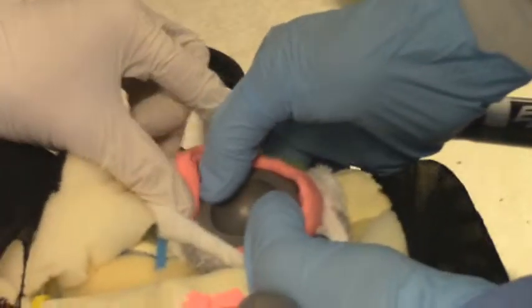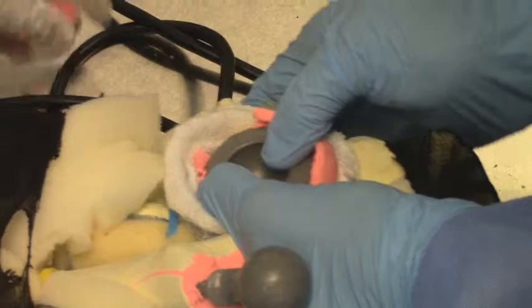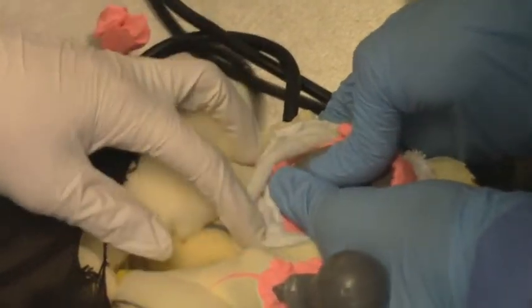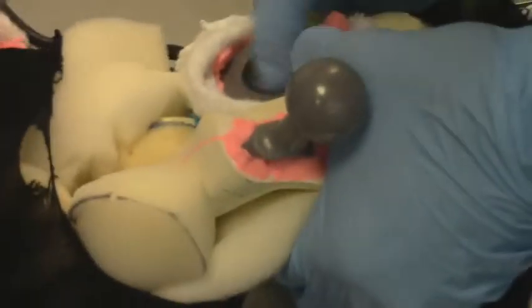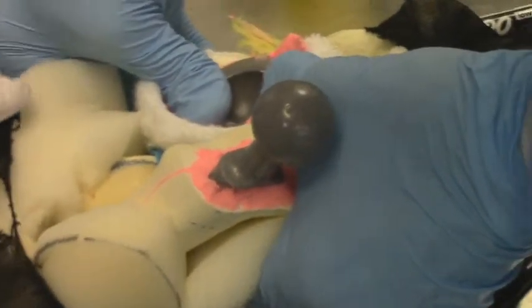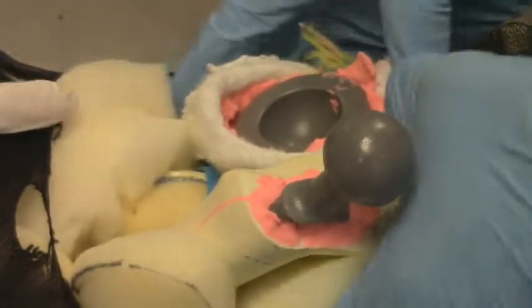Ensure that the components restore the natural kinematics of the hip. The center of the artificial femoral ball should be located at the same approximate location as the center of the native femoral head. Likewise, the acetabular component should be secured in approximately the same location as the original acetabulum. If done correctly, the ball should be stable in the socket with little help from the surgeons.